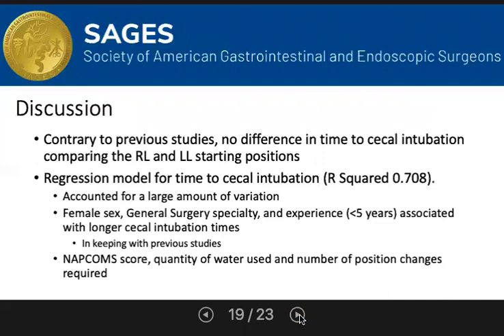Contrary to previous studies, we found no difference in time to cecal intubation comparing the right and left lateral starting positions. While starting position had no effect on the time to cecal intubation, the model developed from this study accounted for a large amount of variation, indicating that the most important variables were included. Similar to previous trials, this model identified female gender as the only demographic factor associated with longer cecal intubation times.